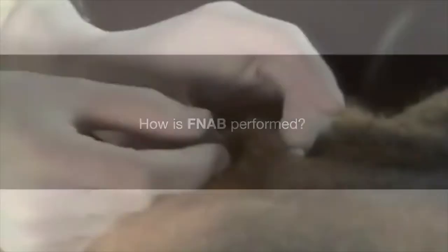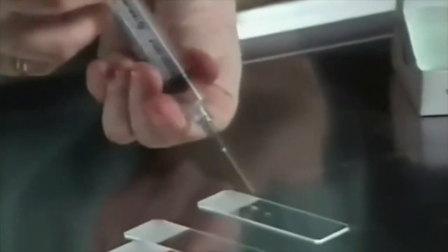During FNAB, a needle is passed into the tissue and successive fast stabbing movements are performed. Once removed, tissue samples are sent to the laboratory for further examination.